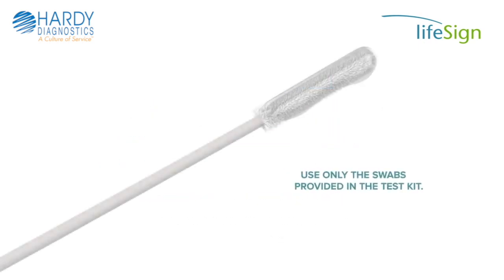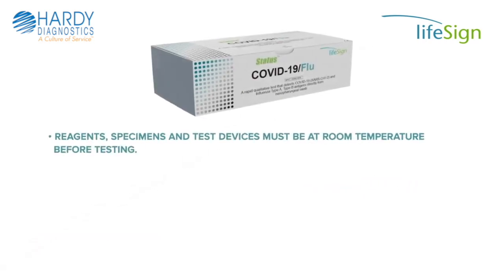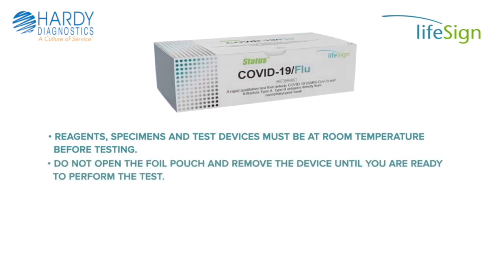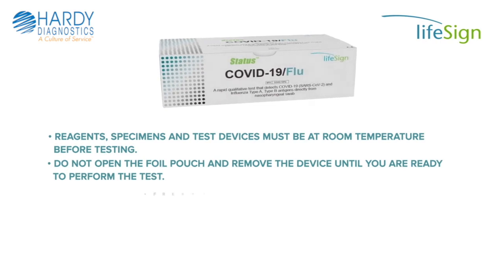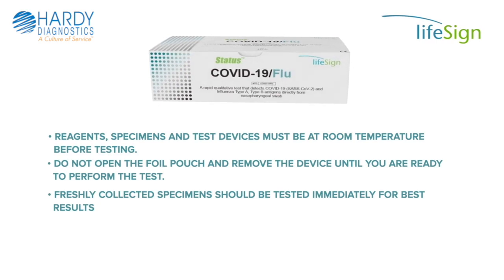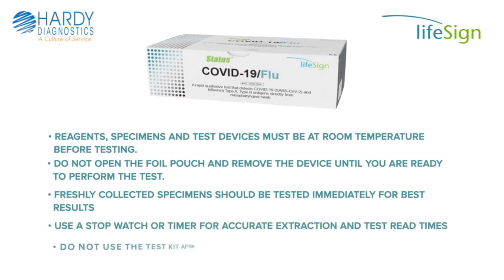Use only the swabs provided in the kit. Reagents, specimens, and test devices must be at room temperature before testing. Do not open the foil pouch and remove the device until you are ready to perform the test. Freshly collected specimens should be tested immediately for best results. Use a stopwatch or timer for accurate extraction and test read times.